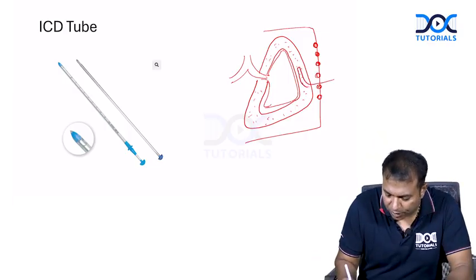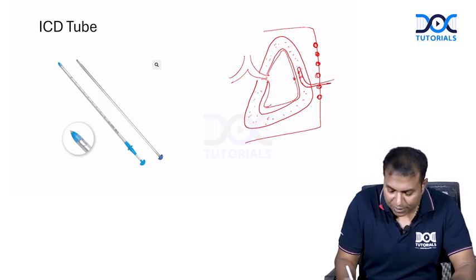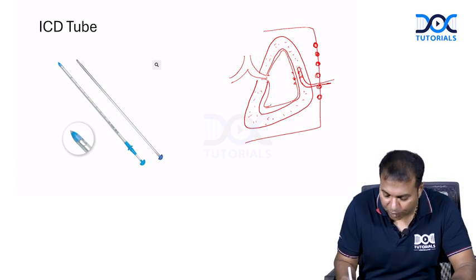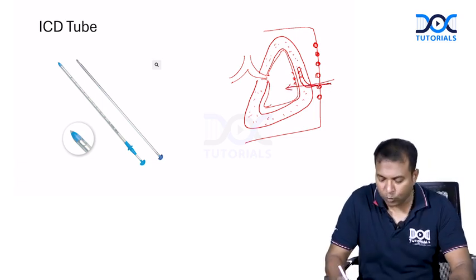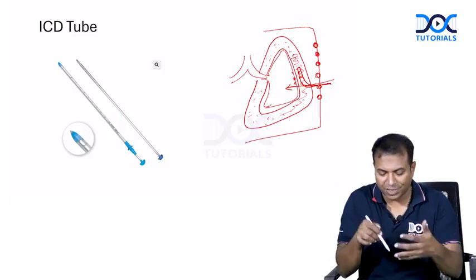Okay, you are going to put it in this space, in the pleural space. You should not go and injure the lungs or the visceral pleura. Please don't forget, I am not going to put the tube into the visceral pleura. I am going to put it only in this space. This is the space where I am going to put this intercostal drainage tube.